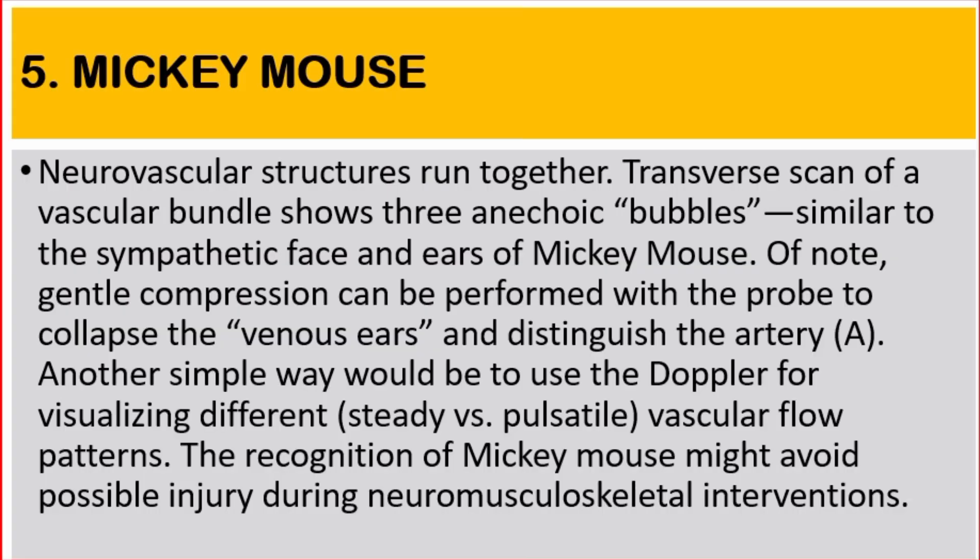Number five: Mickey Mouse. Neurovascular structures run together. Transverse scan of a vascular bundle shows three anechoic bubbles similar to the sympathetic face and ears of Mickey Mouse. Of note, gentle compression can be performed with the probe to collapse the venous ears and distinguish the artery. Another simple way would be to use Doppler for visualizing different steady versus pulsatile vascular flow patterns. The recognition of Mickey Mouse might avoid possible injury during musculoskeletal interventions.